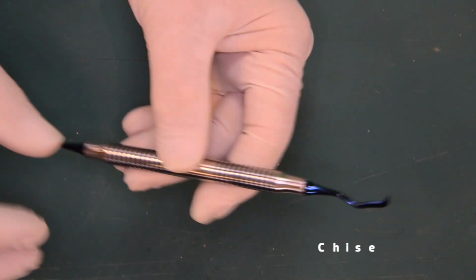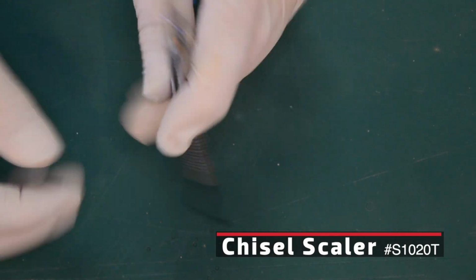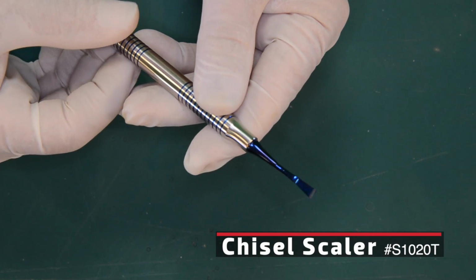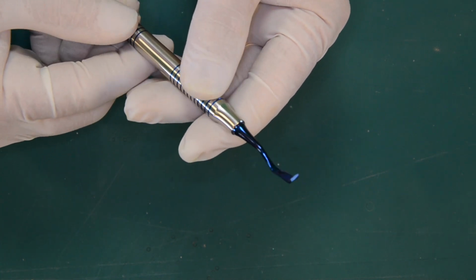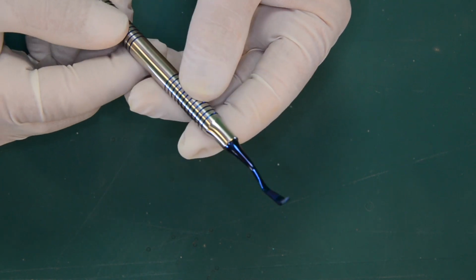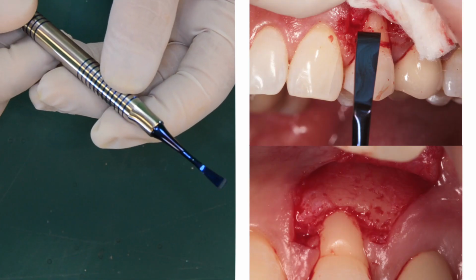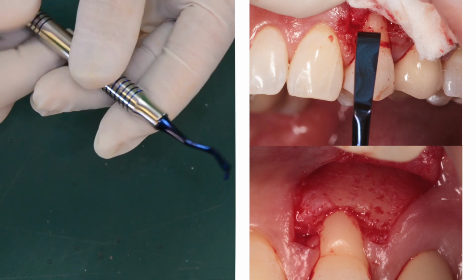The next instrument in the kit is a typical periodontal chisel. We'll use that instrument a lot of times to remove some of the granulation tissue that can get stuck to the bone, but also when you're doing root coverage procedures, this is a great instrument to be able to plane that root and remove that infected surface layer of cementum.